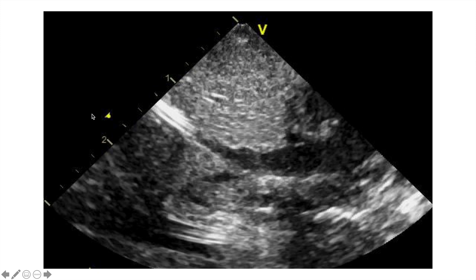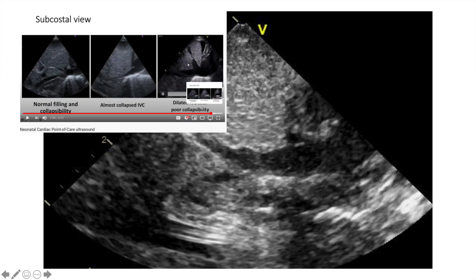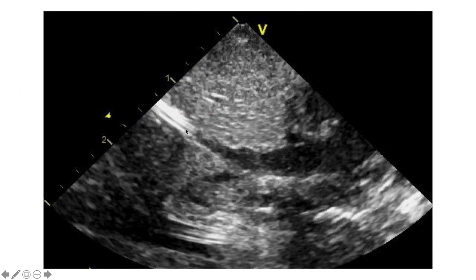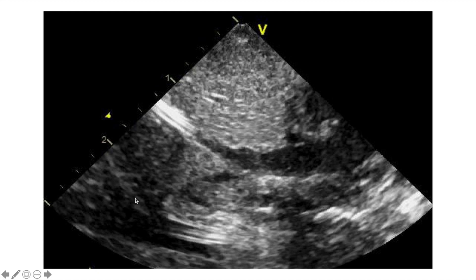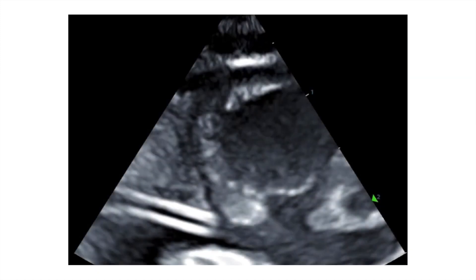This is a subcostal view. If you need to know how to get to this view, please check my previous video. As you can see, the ductus venosus is draining into the IVC-RA junction. There is a line here which is the UVC — the UVC is a little bit short. Ideally, the tip should be close to the IVC-RA junction. The other line you see is the UAC, visible in the abdominal aorta. You can also see the celiac artery and the SMA.